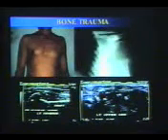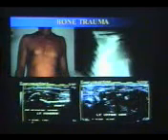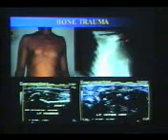After 3 months, the patient came, and you can see in the freely hanging arm, loss of the normal shoulder contour. This is the X-ray which shows resorption over here. Surgical neck of the humerus, humerus diaphysis, head of the humerus, part of the scapula, part of the acromion, and part of the clavicle, they are all gone. The patient was not having any pain, and this is the ultrasound which shows you destruction, head resorption, and this is a neuropathic joint.